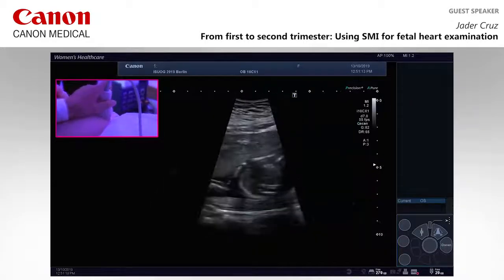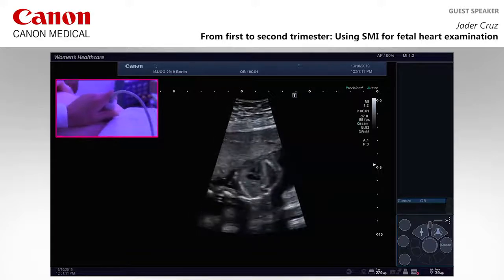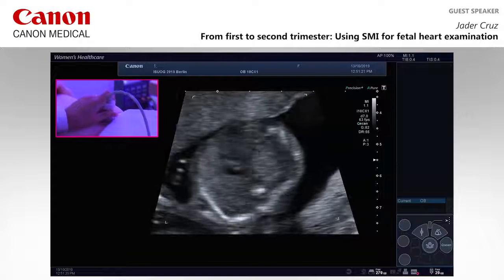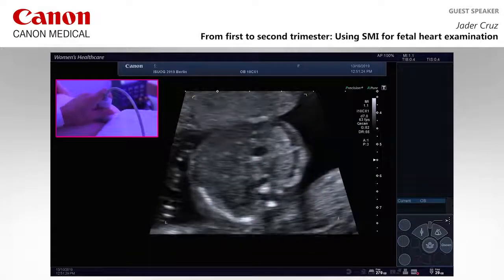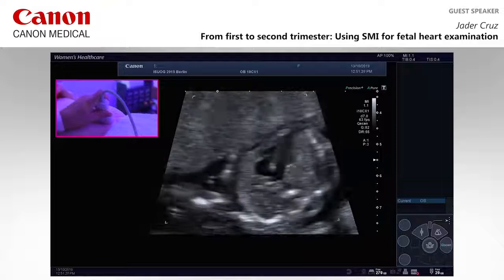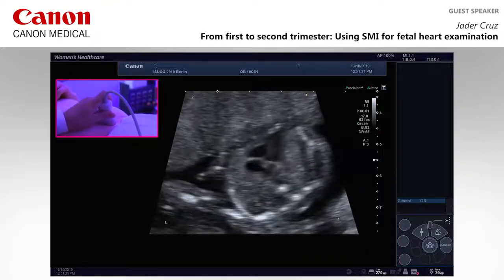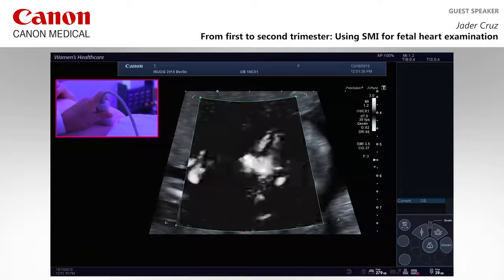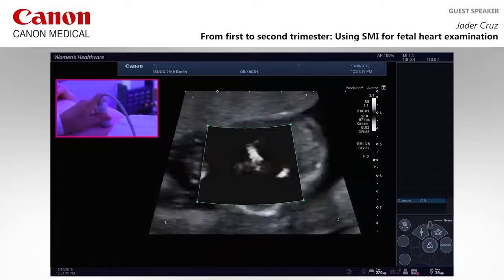We move now to a live scan of the heart. There is the baby — 17 weeks. 20 weeks would be nicer to show, but you can see. We will switch on the SMI and adjust the presets a little, as we're still working on the settings.